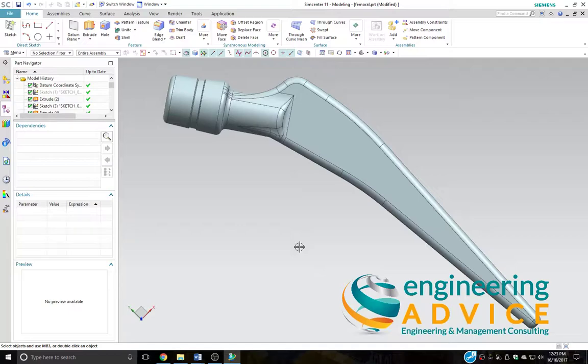So I've uploaded my part already. This is a femoral stem. It may be a SimCenter or Annex part, or you may have imported it from a third-party software.